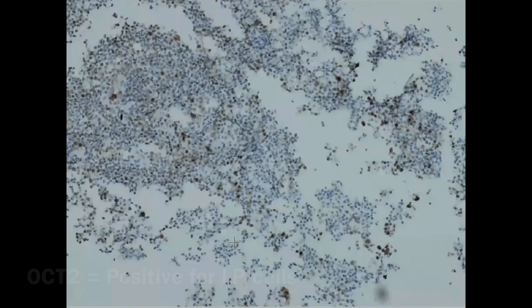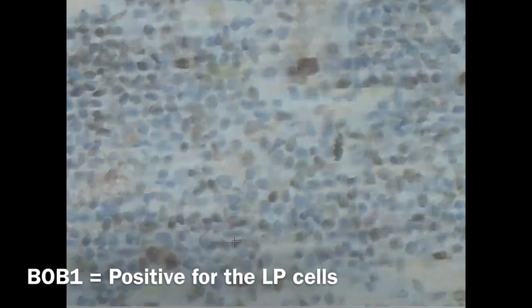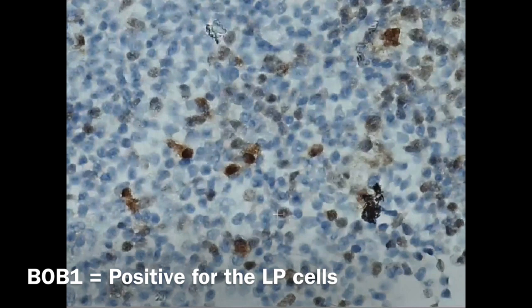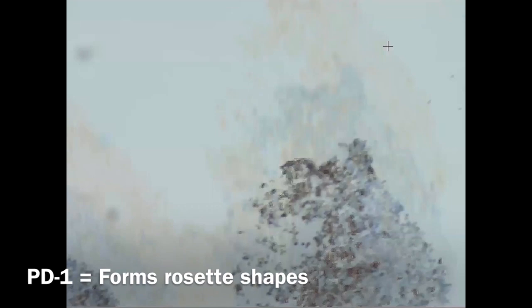This is the Bob1 stain. At higher magnification, you can appreciate this big cell taking the Bob1 stain with other B cells taking the stain surrounding it — so this one is Bob1 positive. This is the reverse compared to classic type. Another big cell here, looks like a popcorn cell, and it's taking the stain. So OCT2 positive and Bob1 positive.